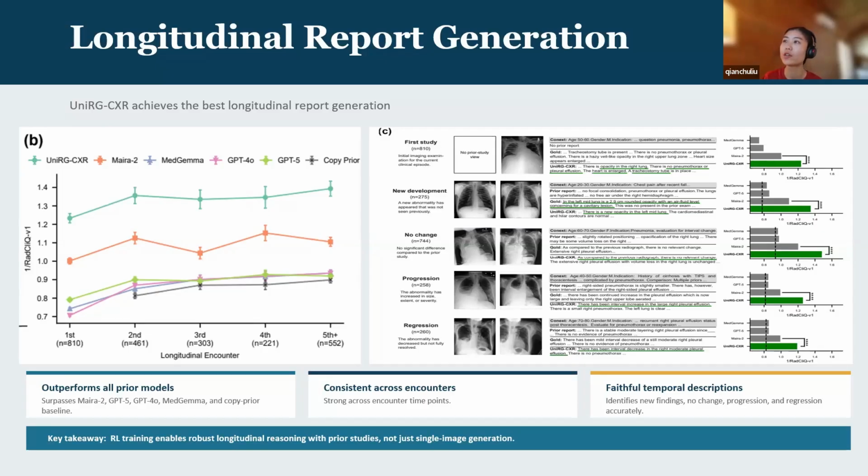But as we mentioned earlier, the clinician or radiologist will typically refer to prior information when writing the report. And this is evident when we read some samples of radiology reports.